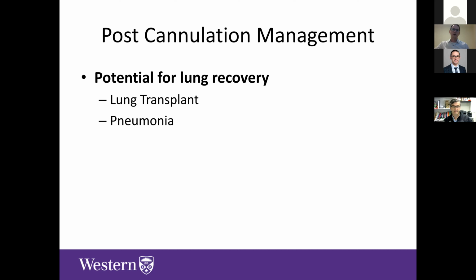So if that's one extreme, that you don't expect the lung to recover at all, and you're really taking full advantage of ECMO. The other extreme is probably the very bad pneumonia, which is a case that happened at CCTC just last week. Someone rapidly decompensated because of a Staph aureus pneumonia, and they really reached the end of what you could safely do on the ventilator. So they were put on VV ECMO and transferred to UH. And all we really did in this case was rest them for a bit and let them get over their shock. And then start to wake them up, stop paralyzing them, and see if their lungs had recovered.